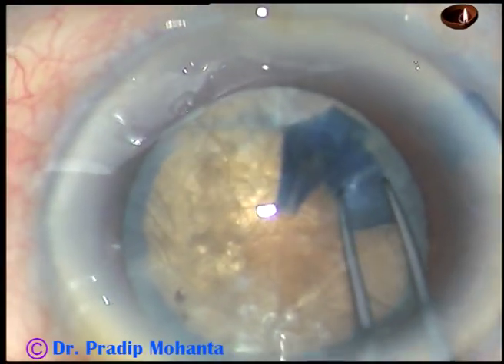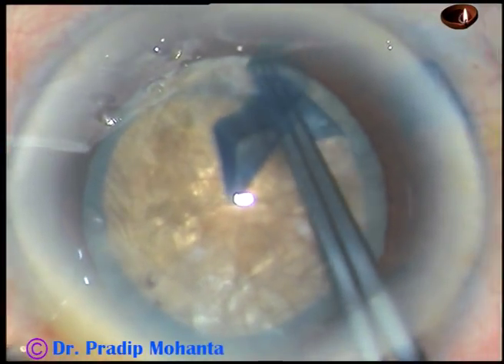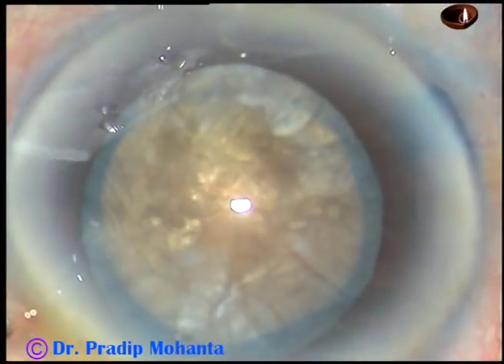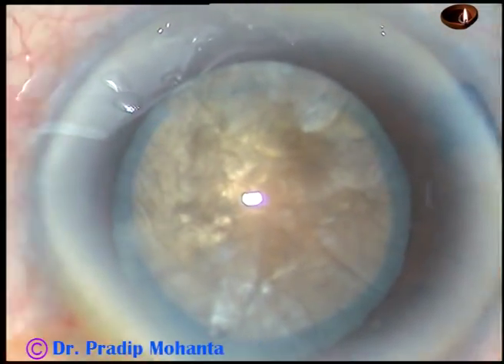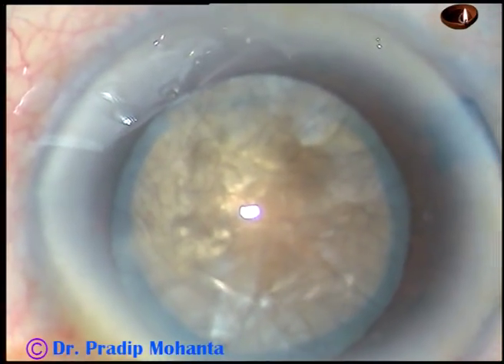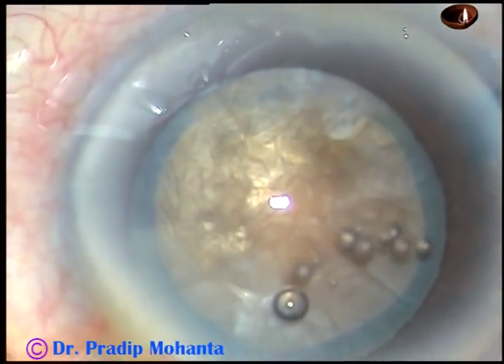Intumescent cataracts can have any kind of nucleus — it can have a very soft nucleus, a nucleus of moderate hardness, or this kind of hard nucleus.